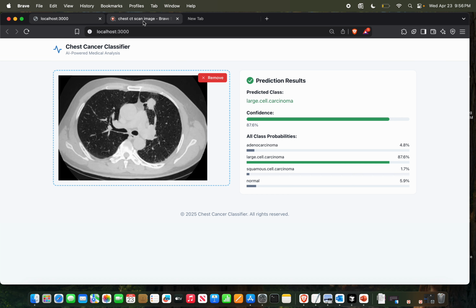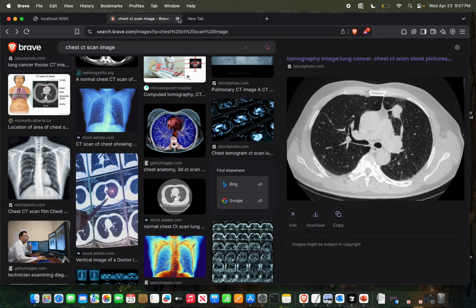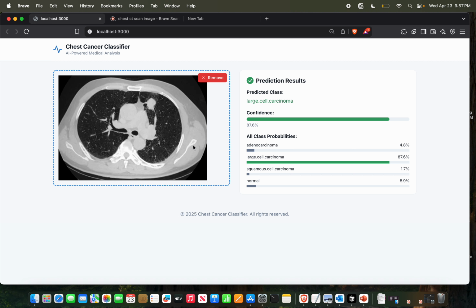We can also try with different images, but in the end I want to say that the main issue we faced in this project was getting more CT scan images, because we used almost all the CT scan images that were publicly available on Kaggle. We had difficulty in this phase because we wanted to test if our model really worked, and we only found 3 or 4 valid images that we could use to test our model.